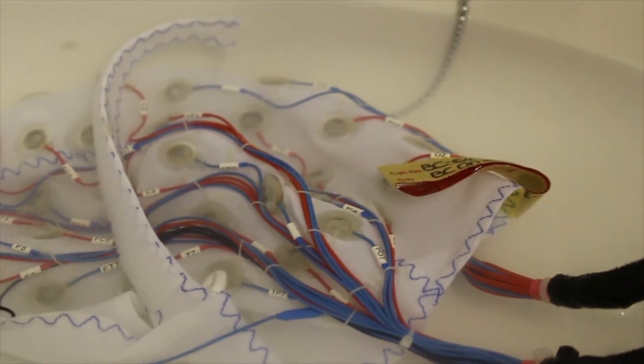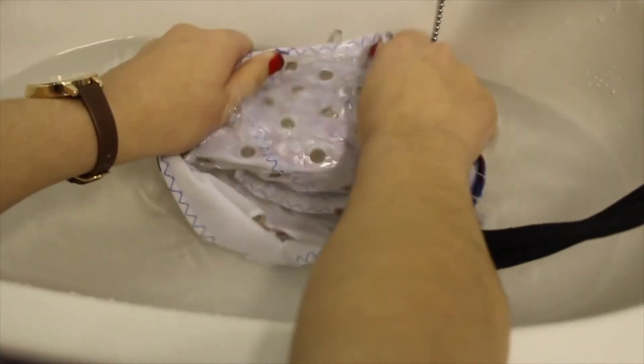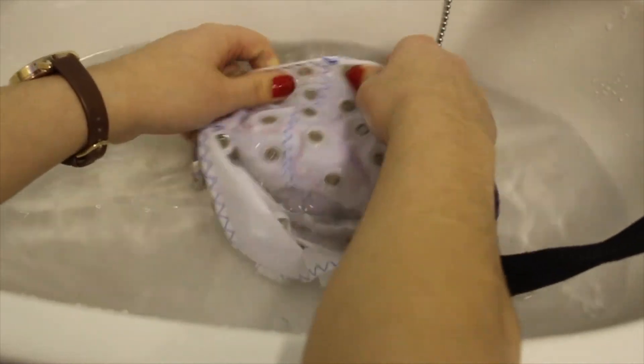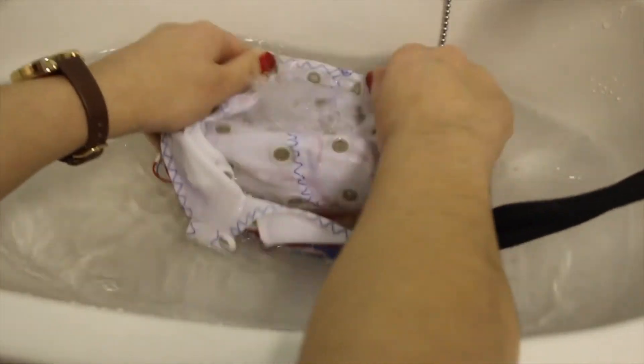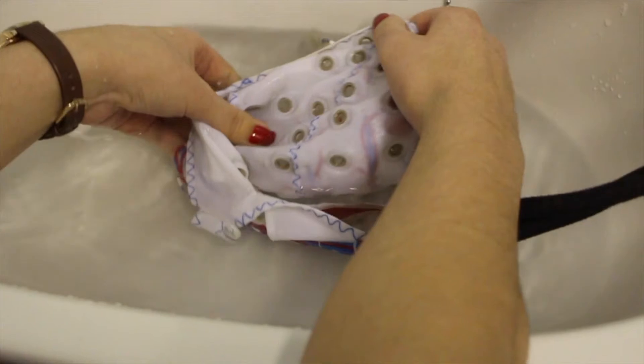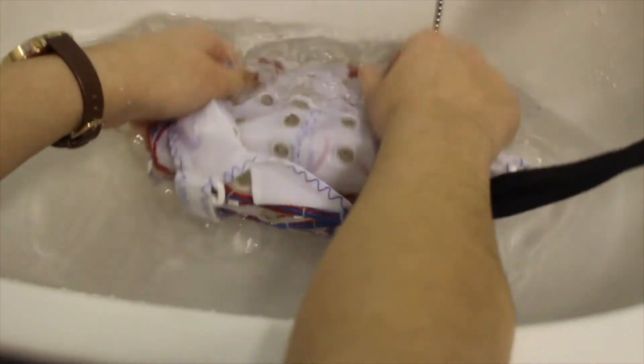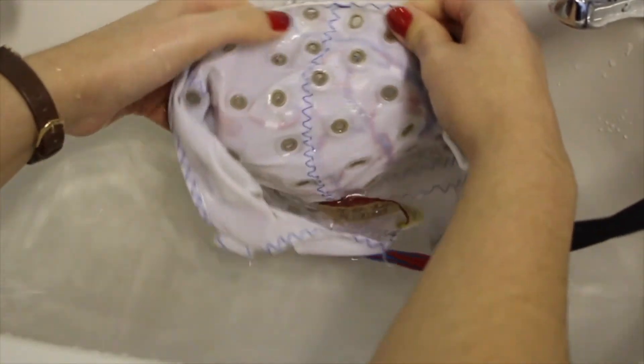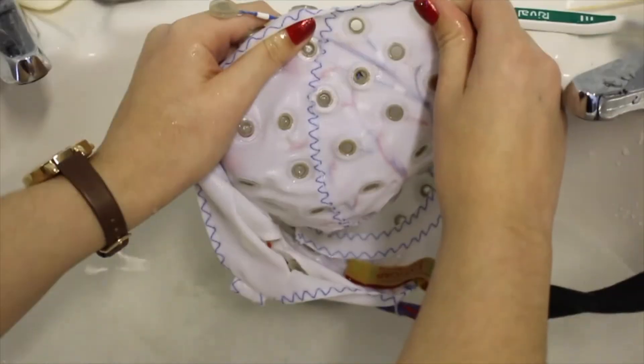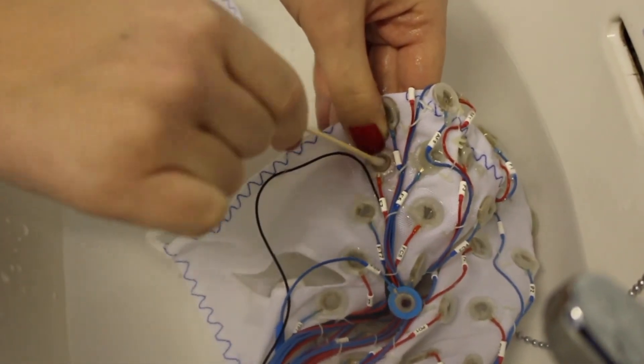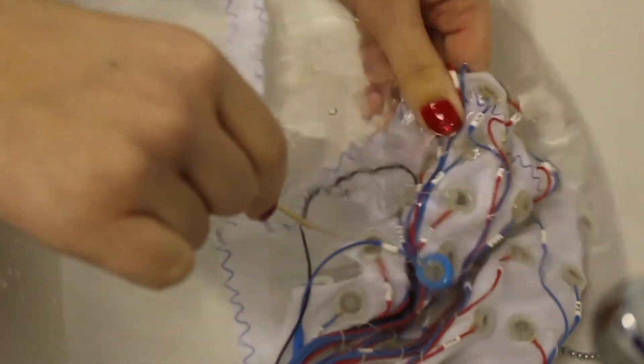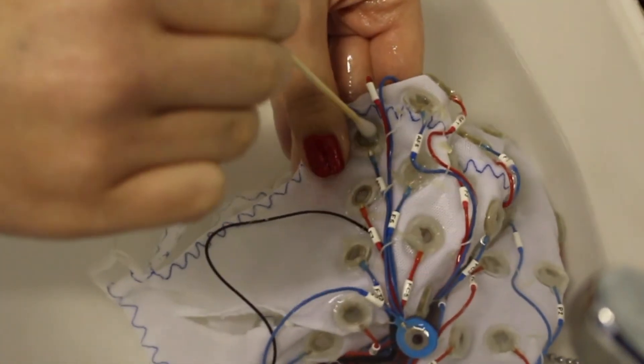After the cap has soaked, you can begin getting the gel out of the electrodes by flattening sections of the cap and pushing water through by moving it back and forth as shown. This will dislodge a large amount of gel without the need for anything abrasive. You should then go back with a cotton bud and gently clean away any gel that may be left, pushing it through to the inside of the cap. Do this for all of the electrodes, not forgetting the reference and ground.